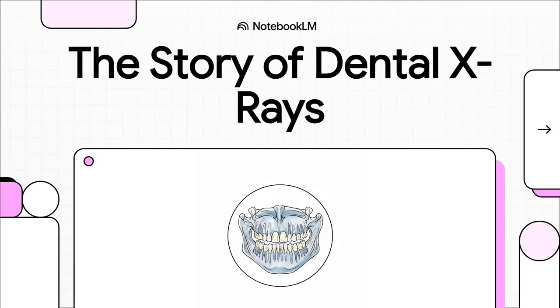You know the drill. You're sitting in the dentist chair, they drape that heavy apron over your lap, and you bite down on a little piece of plastic while they aim a machine at your cheek. But what's actually going on in that moment? Well, today, we're diving into the incredible story of the dental X-ray, from a really dangerous discovery to a cornerstone of modern medicine. So, let's get into it.